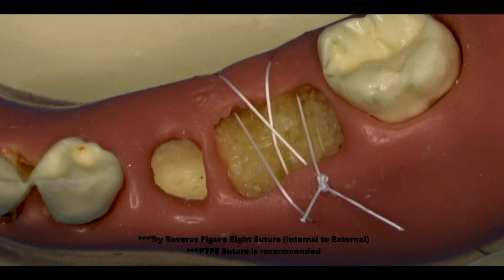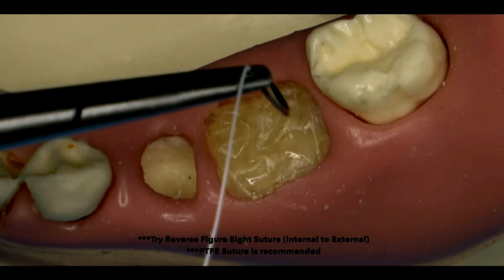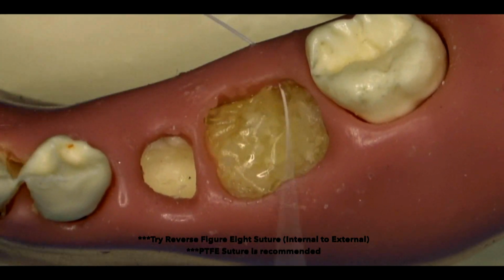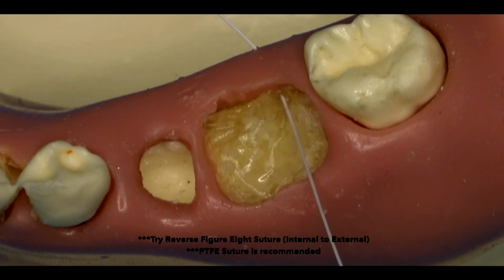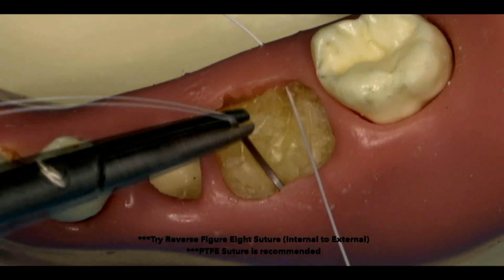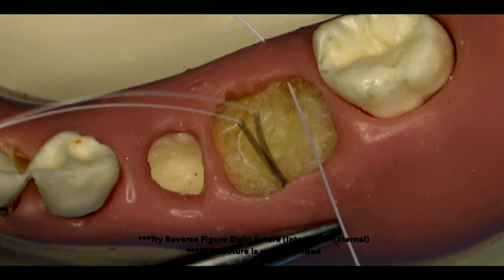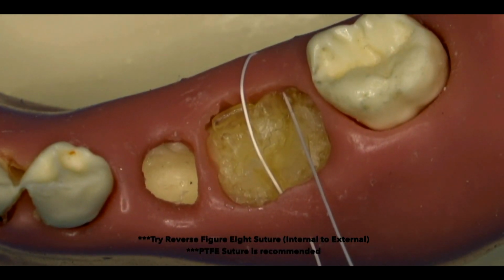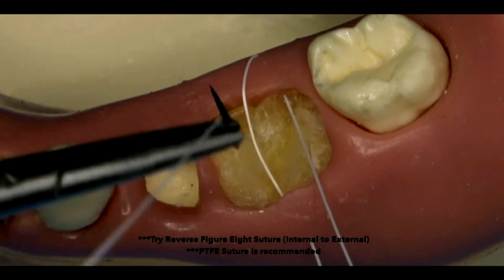And then we can go ahead and suture this. This is not to get primary closure. We're trying not to put any tension on the margin, but what we don't want to do is pull that membrane out, because once we have it nice and settled over our socket, if we try to put a suture through it and it pulls out, then you got to start over. So we'll just go from internal to external. So we like to call this like a reverse figure 8 suture, and we're just going internal to external, trying not to grab the membrane.